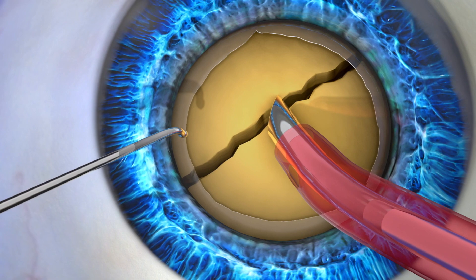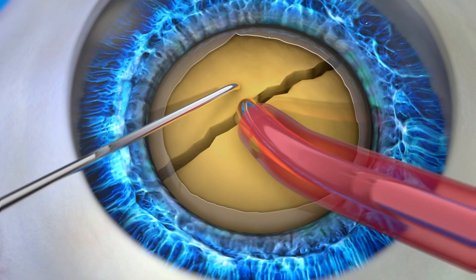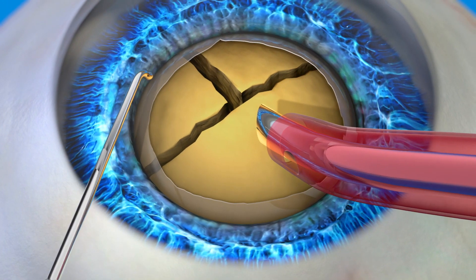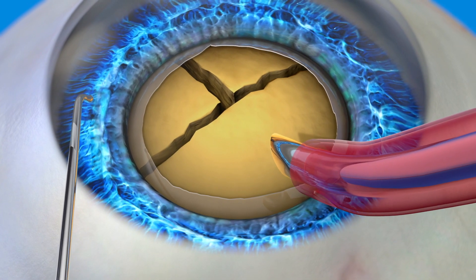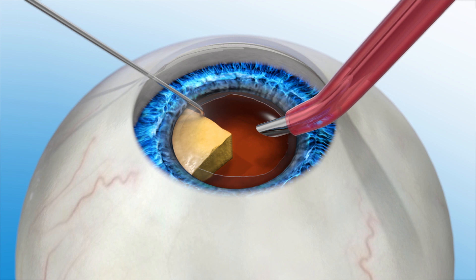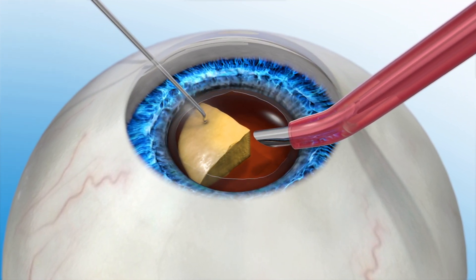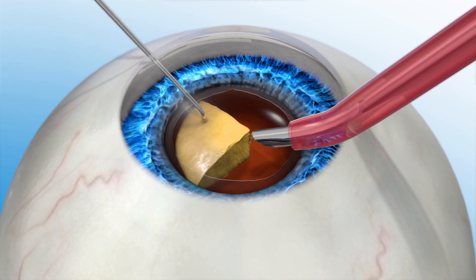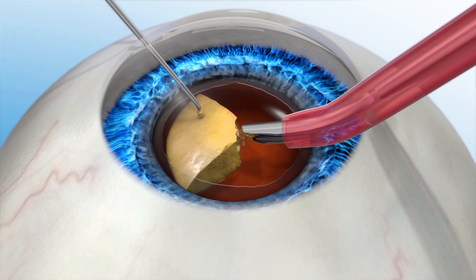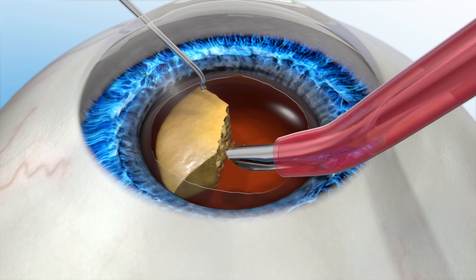The next step in the procedure is the removal of the cloudy lens. During a manual cataract procedure, the cataract is broken up into small pieces in preparation to remove it. A handheld instrument may be used first to break up the lens into a few large pieces, then ultrasonic energy is used to break it up into smaller pieces before it can be suctioned out. It's important to note that when less energy is used in the eye to remove the cataract, the quicker your vision will recover. Less energy also reduces the chances of complications.